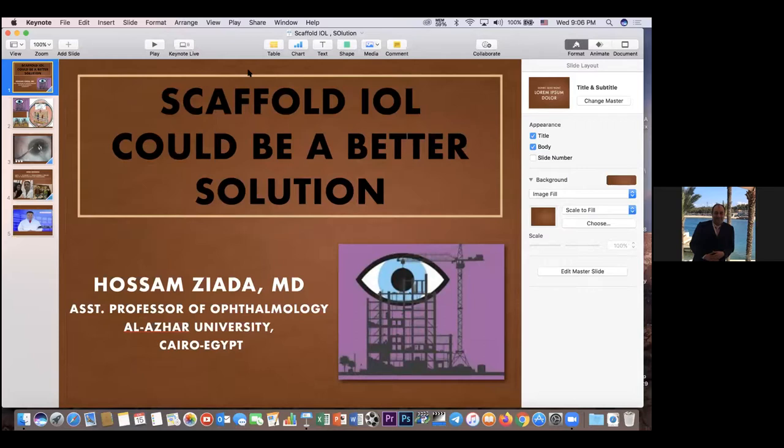I think, sir, if it's still the same size or less than the pupil, with the IOL optic, we can do it. If it's larger, then I will be scared of putting the IOL in the bag. If you have a three-piece IOL, you could have more than the optic. No problem.